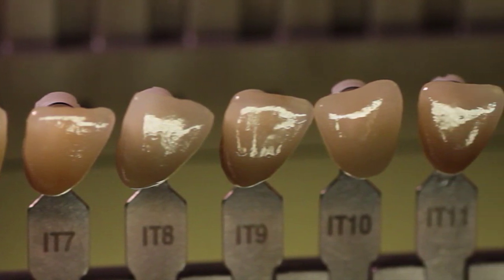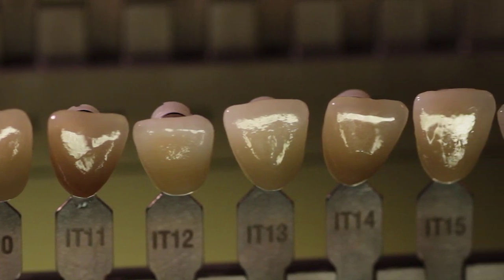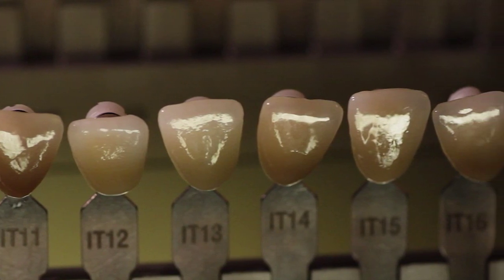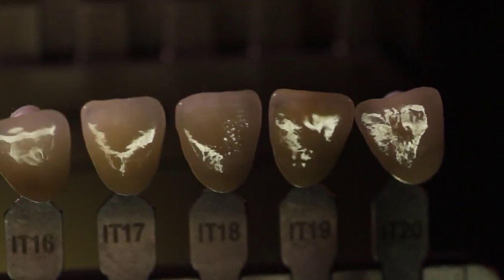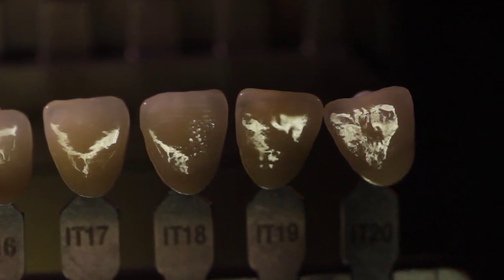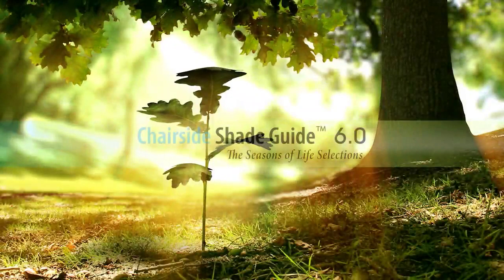So, in order to correctly match a person of later years' dentition, we must take these modifications and possible staining into consideration. The shade tab variations are based on natural dentition, as seen in a patient's mouth. As a direct result of in-depth research, we are able to offer a true repetition of lifelike enamel colors.